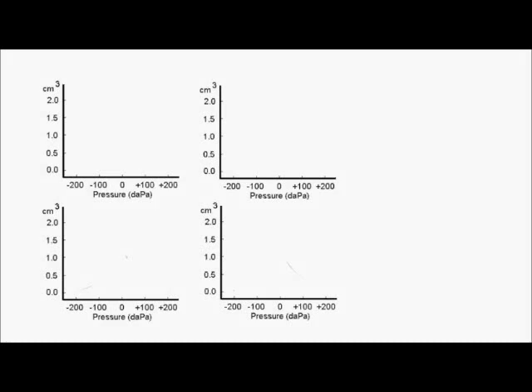Hello and welcome. In this video, we will discuss other portions of the audiogram test, including tympanometry and acoustic reflexes, which are both measures of impedance. Let's begin with tympanometry. These figures are tympanogram templates.